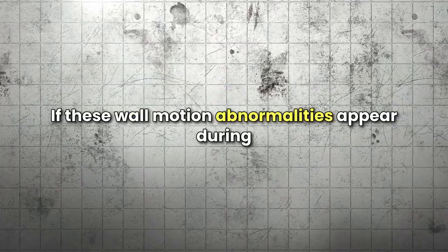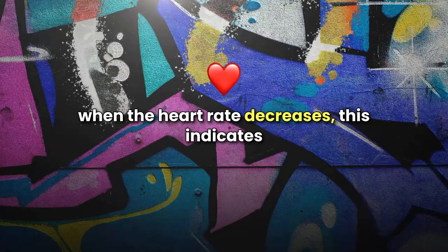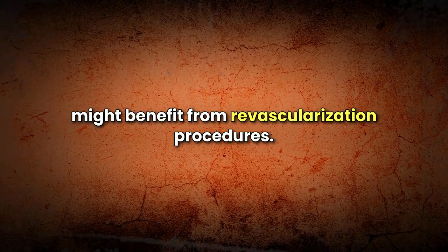If these wall motion abnormalities appear during dobutamine infusion and resolve after the test when the heart rate decreases, this indicates reversible ischemia, a hallmark of CAD that might benefit from revascularization procedures.